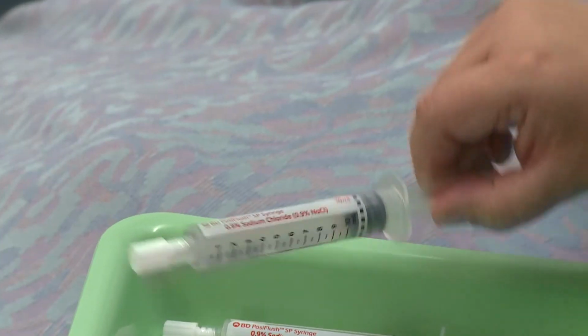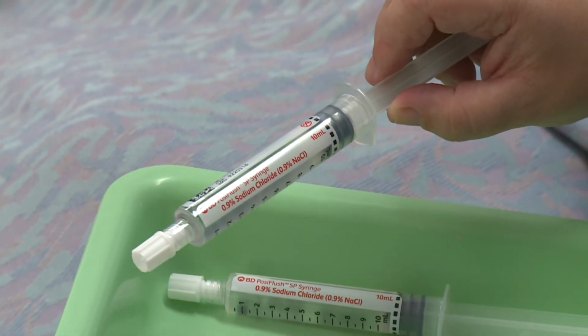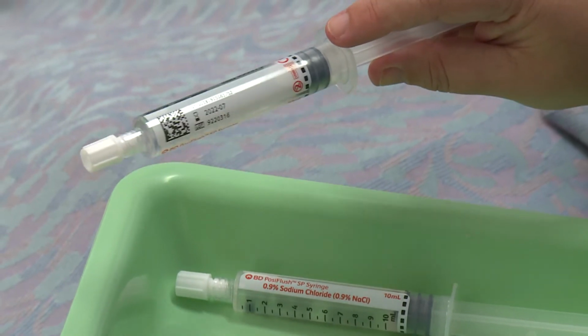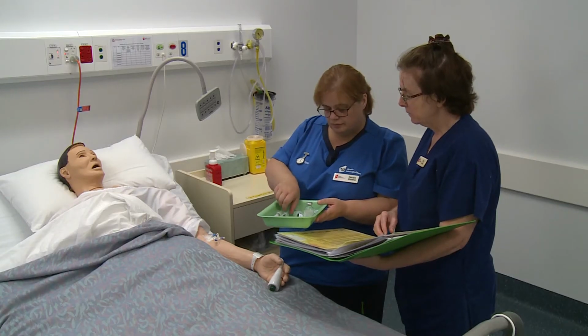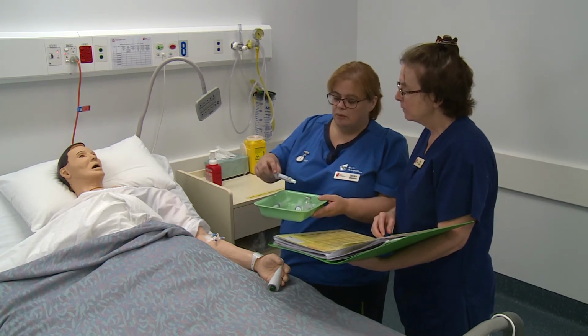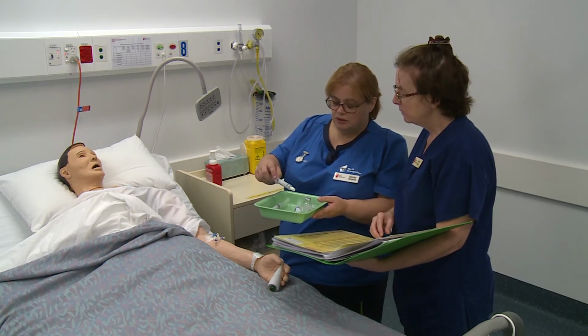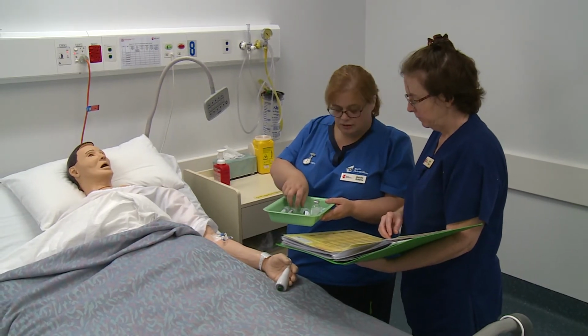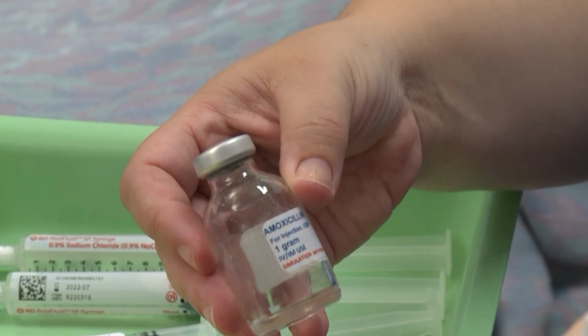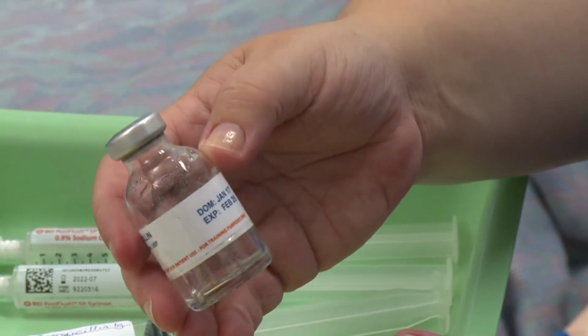Okay, so here I've got my sodium chloride 0.9% pre-flush, expires 2022. I have my 0.9% sodium chloride, expires 2022, and that's my post-flush. Okay, so I have amoxicillin 1 gram, expires February 25.